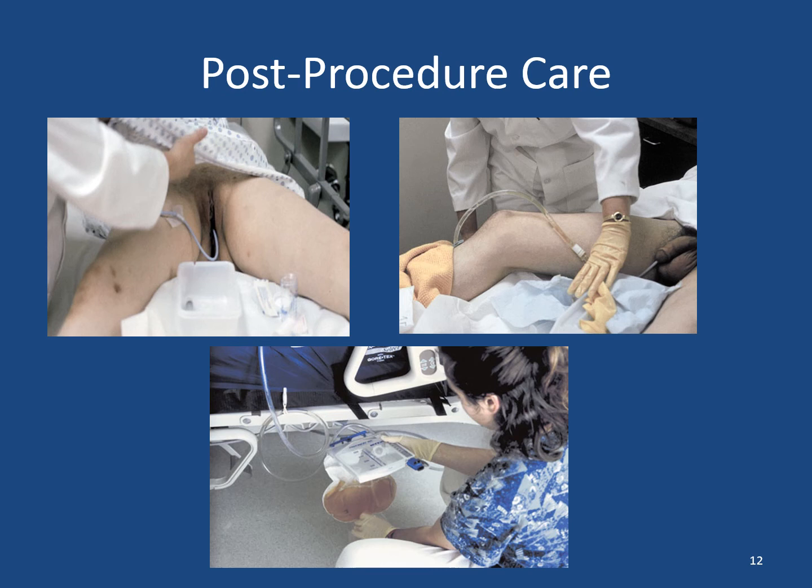For care, we would want to make sure we're providing peri-care afterwards to remove any of the solution left on the client. And then we would want to make sure that we're providing peri-care daily with soap and water or the catheter wipes every day or every shift or as needed as well for the client. We want to encourage the fluid intake, PO intake of 2,000 to 3,000 mLs per day to keep that catheter patent and make sure that we're preventing infection.